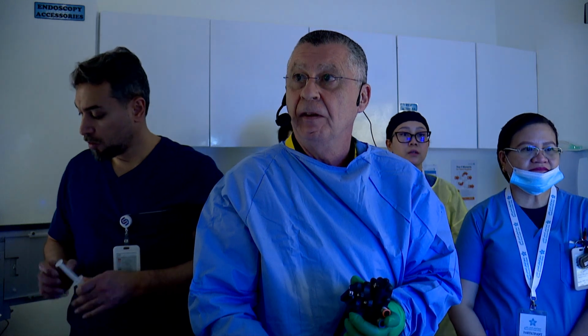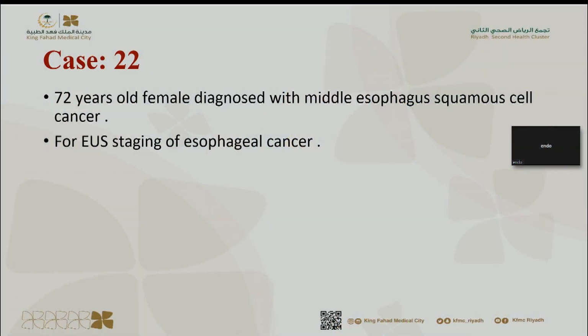We'll get back to you. Thank you. Yes, old lady, diagnosed with middle esophageal squamous cell cancer for EUS staging of esophageal cancer.